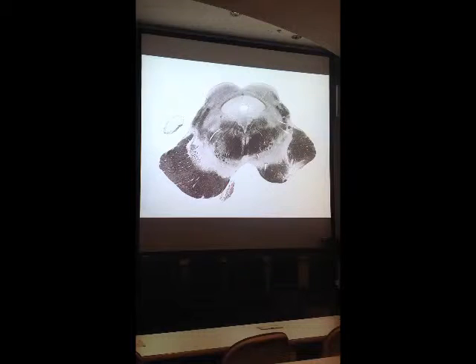So this section, because it shows the oculomotor nerve, goes along with the superior colliculi. At this slide, 24, there's the superior colliculi, the major landmark. Now again, if this is the third nerve, I would expect you could see some of these axons that are going to eventually exit from here to form the third nerve, and some which have yet to exit.